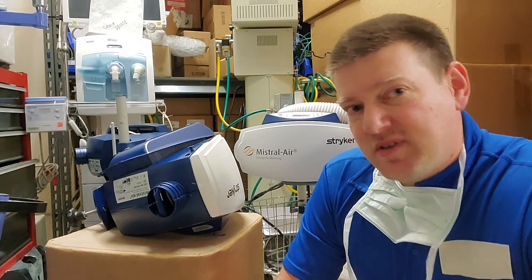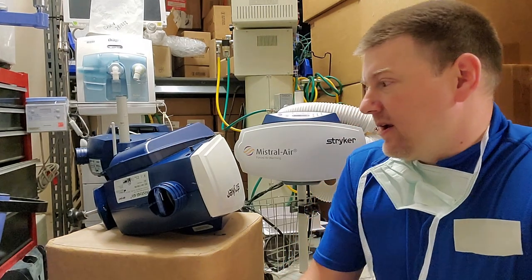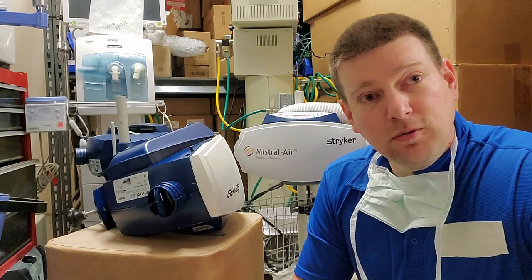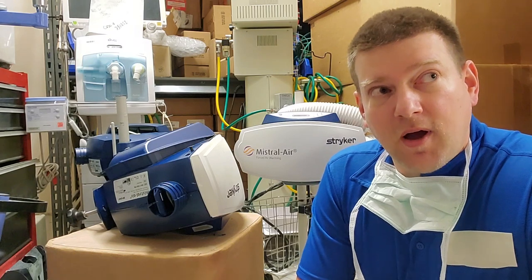A normal body temperature is 98.6 degrees Fahrenheit or 37 degrees centigrade, and some of these units can go up to 41 degrees if I remember correctly, so that is very hyperthermic.